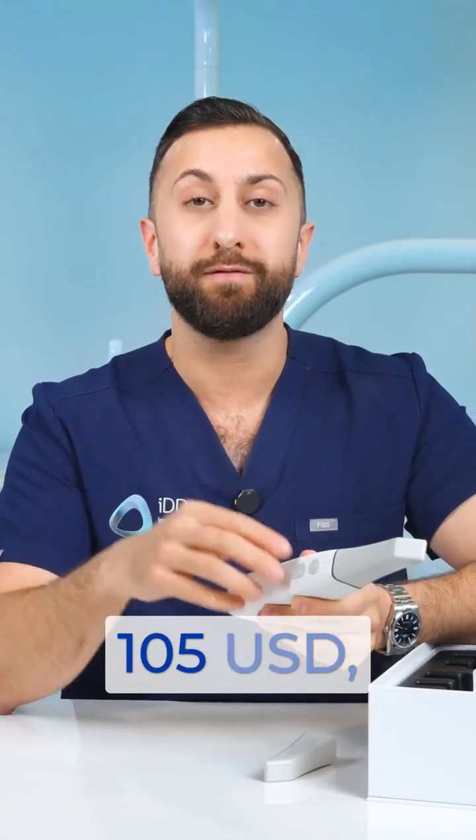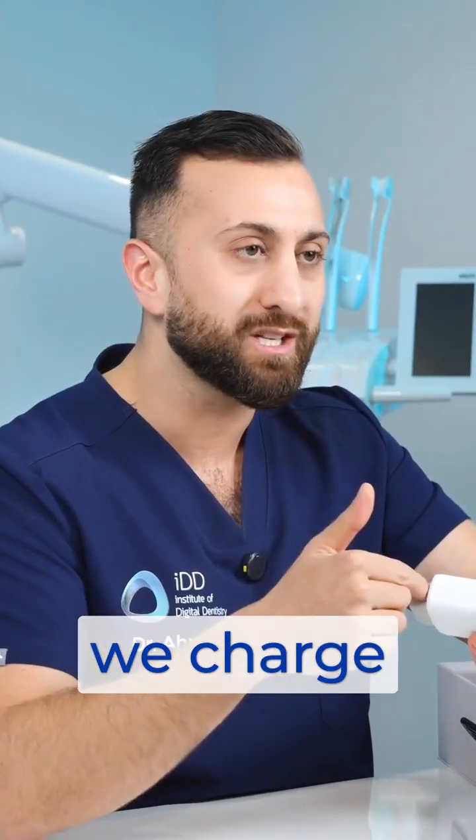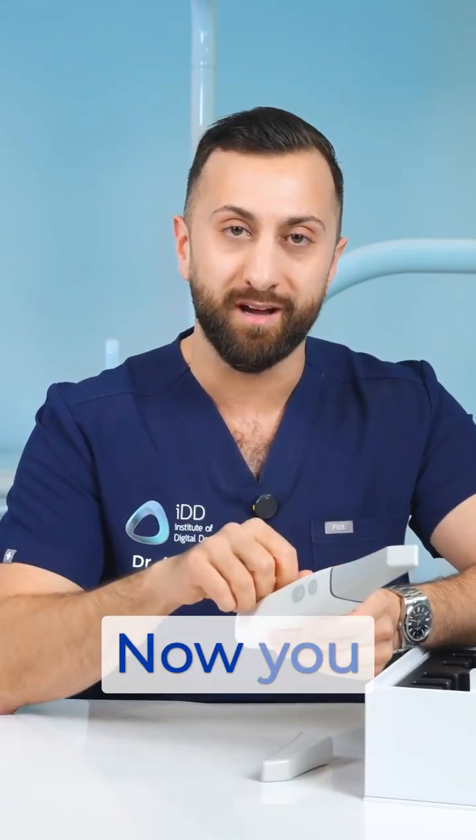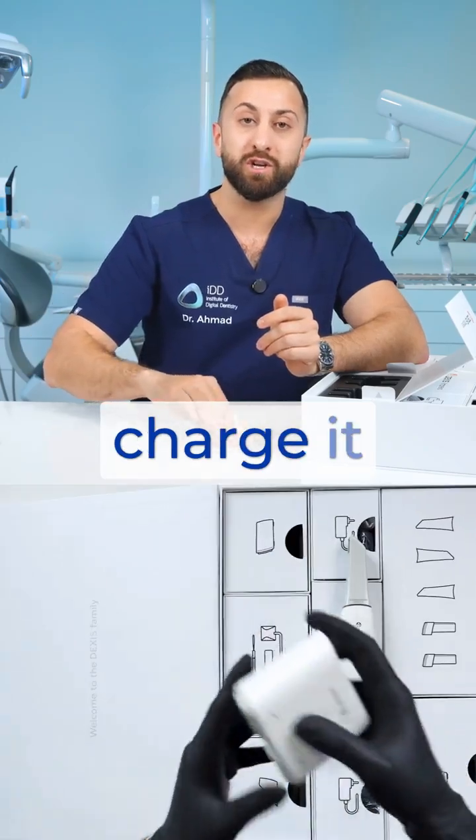Each battery costs around $105 USD. The next question is how do we charge these? Well, the company actually gives you two options: you have a separate battery charger, and you can also charge it through induction charging.